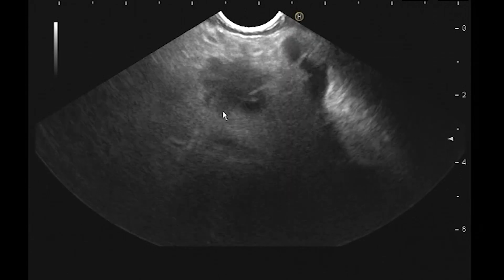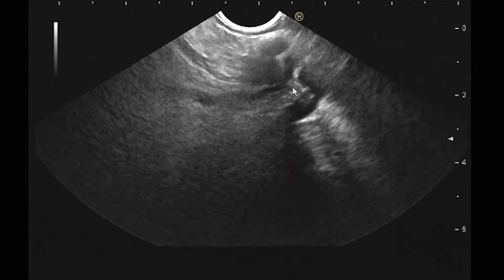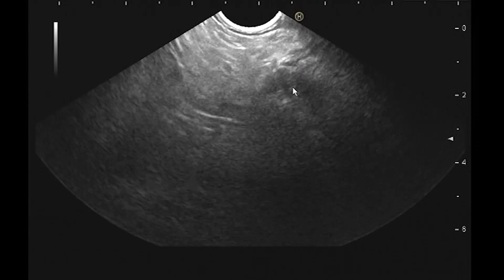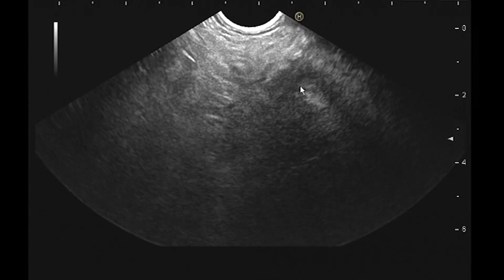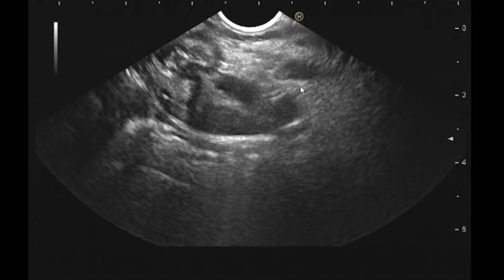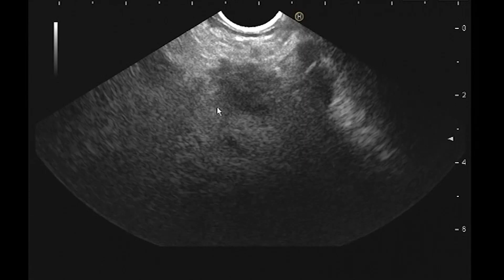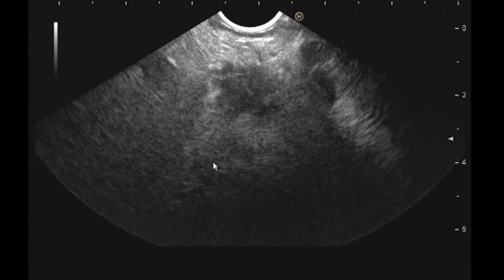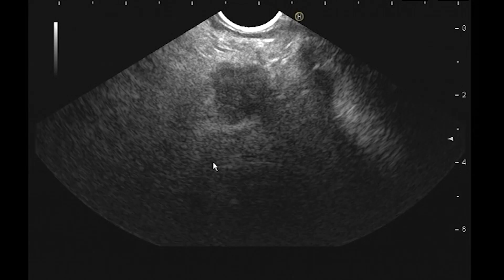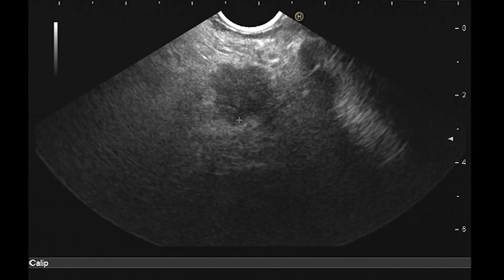Her PD is probably dilated, and her pancreas above it looks kind of atrophic — the whole thing. There's a bit of dilated duct and atrophic pancreas. What you want to see is whether the whole pancreas looks like this or if there's really a transition zone. I suspect there's a serious transition zone.